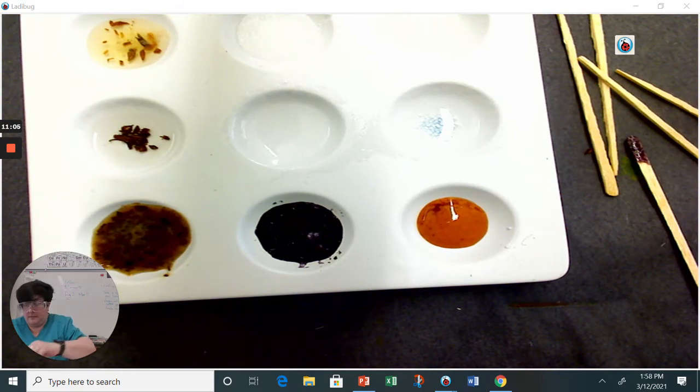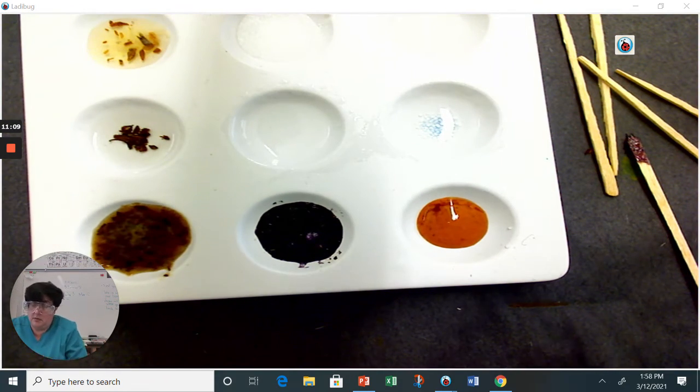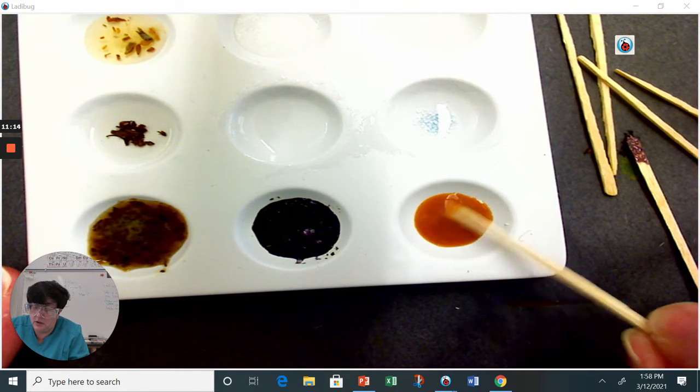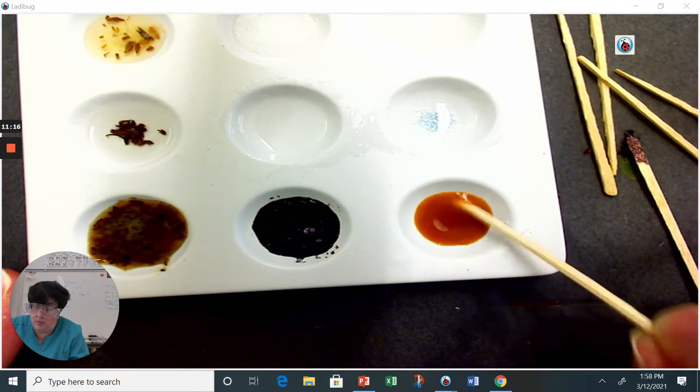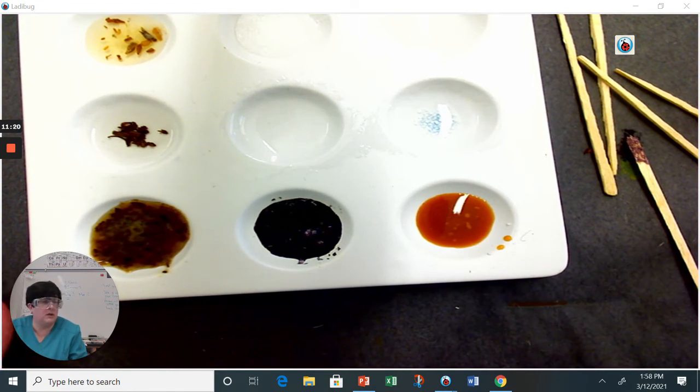And then get another one. This one is different than the starting material. It's getting a darker color. Very opaque, brown, almost ruddy, where the crystals interact with the material.